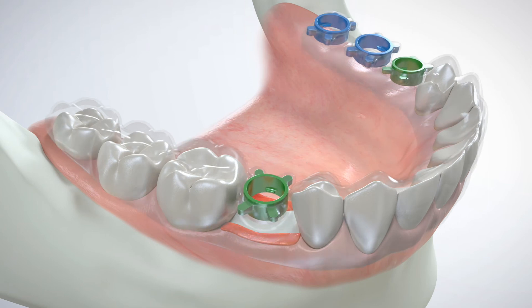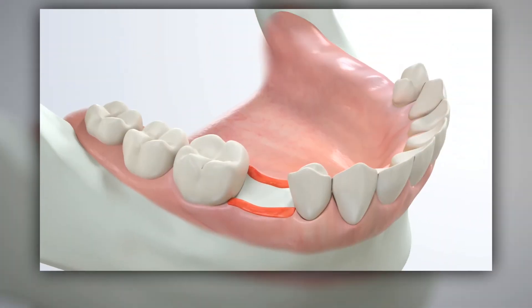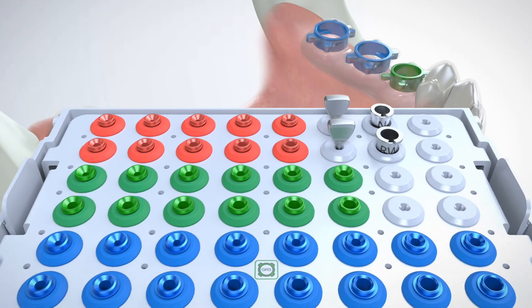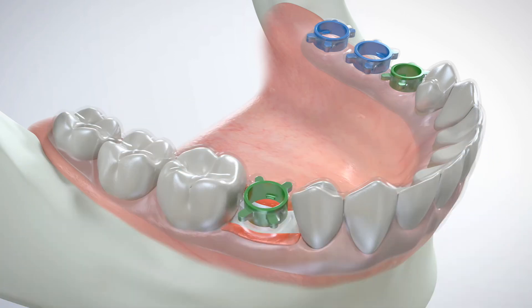A GRS surgical guide is placed onto the teeth or secured to a completely edentulous ridge using fixation screws. All types of surgical guides, from milled to 3D printed, can be utilized for any surgical procedure. A GRS surgical drill sleeve matching the diameter of the initial drill in a surgical sequence is removed from the cassette using the GRS IR tool.